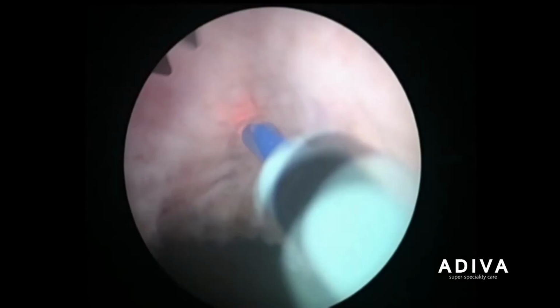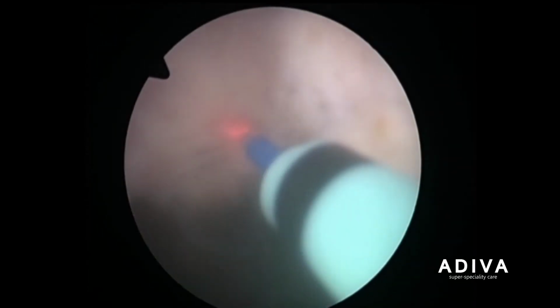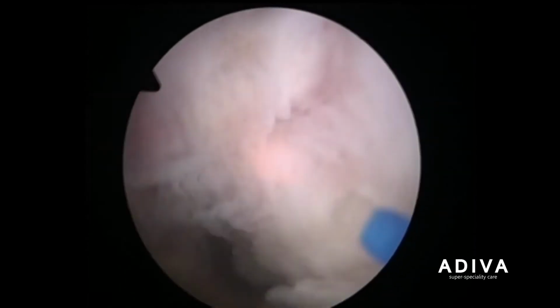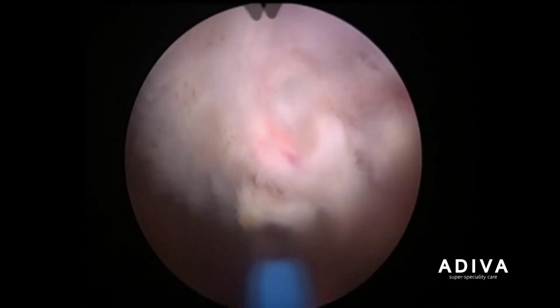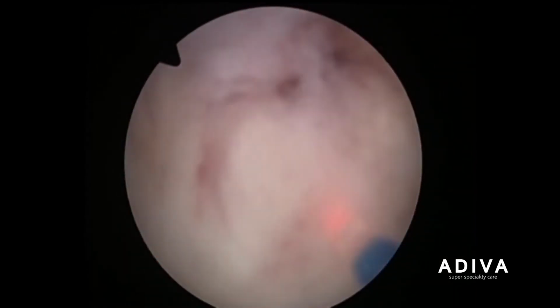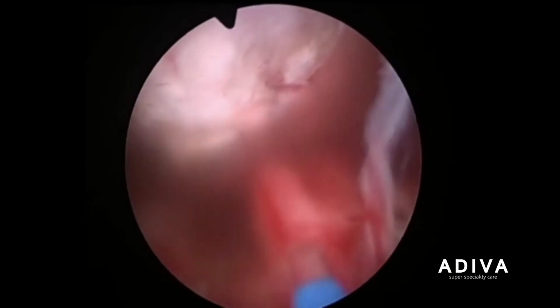With this, I would like to conclude the procedure. This adenoma is removed by a process of morcellation and all the pieces are taken out or sucked out. Thank you very much.